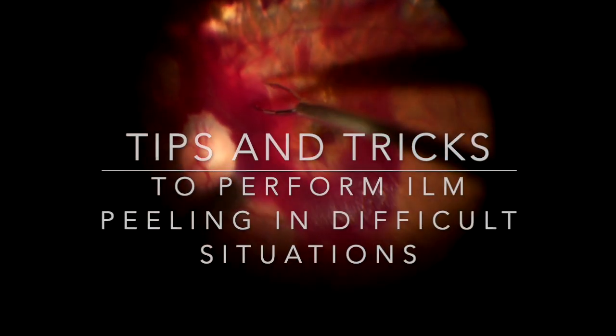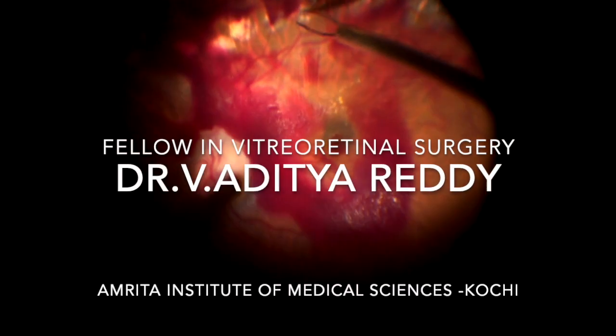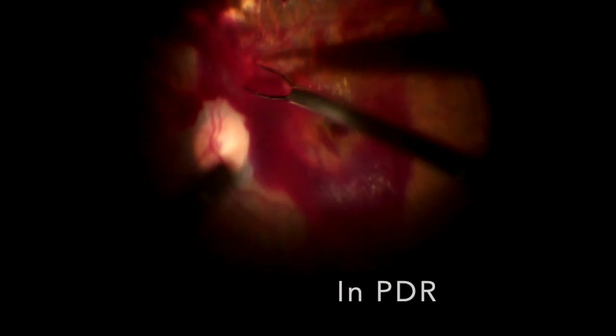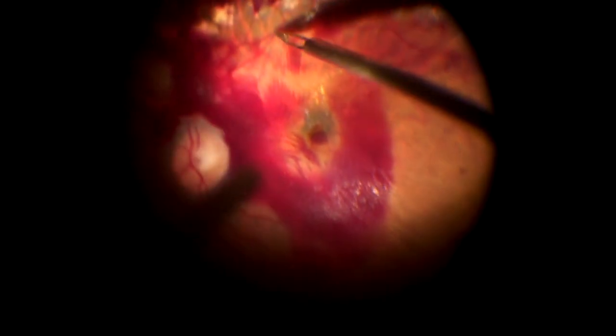In this video, we will be showing the nuances of ILM peeling in difficult situations. Here is a case of proliferative diabetic retinopathy, and you can see the shining taut hyaloid and under which there is a lot of bleed.